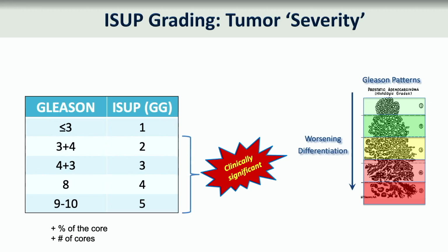But more recently, the popular way of looking at it is in the Gleason group grading. And here you can see that if we have less than 3, it gets a 1, the 3 plus 4 now a 2, etc., and you can read the rest. But this is largely where we're migrating. So you'll see through this talk, I'll be going back and forth between these two elements.